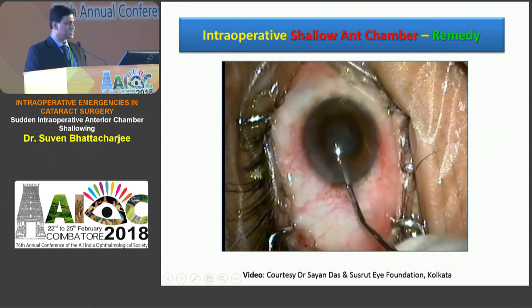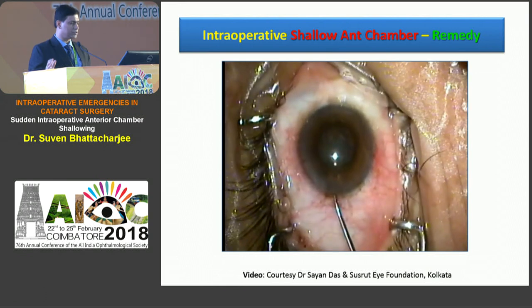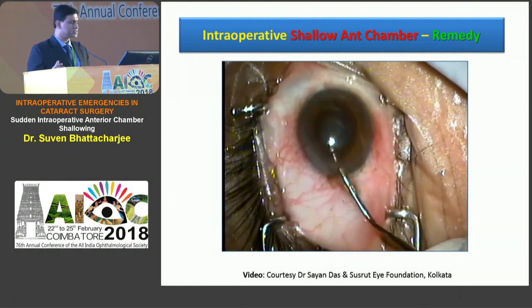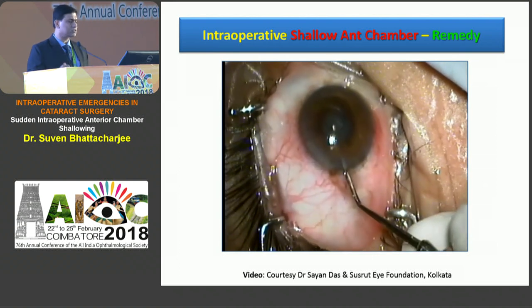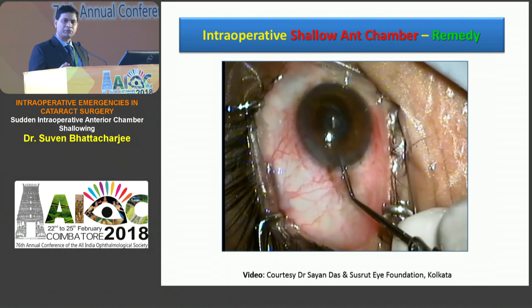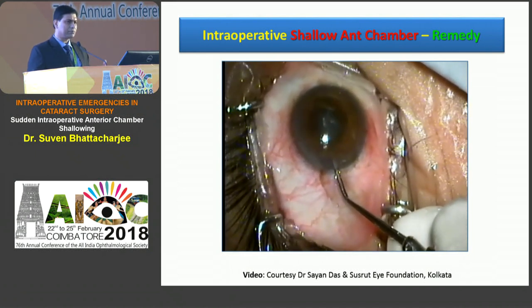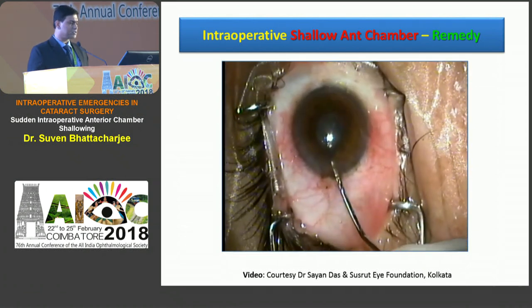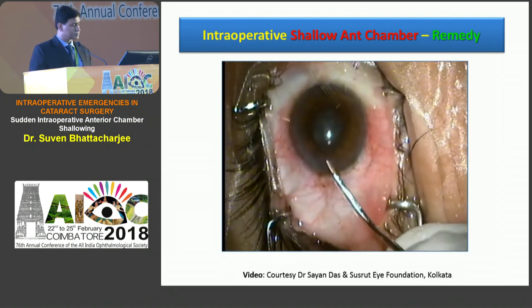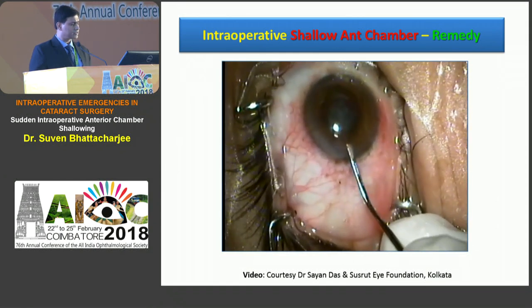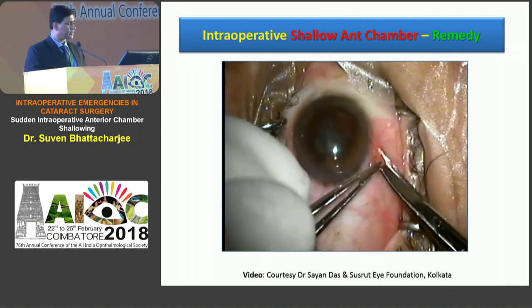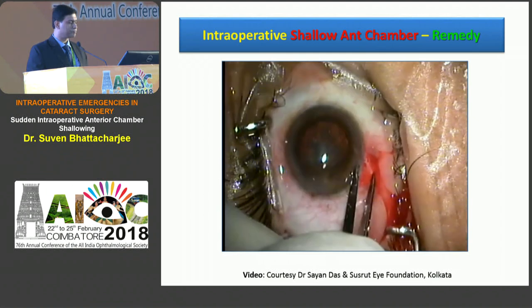In the video, the surgeon managed to reposition the iris. The supervising surgeon assessed the eye as hard. They realized a lot of fluid had been pushed into the bag and surrounding space, so they began constantly decompressing the capsular bag area — pressing and pressing — which caused some fluid regurgitation and the eye began softening, but it wasn't good enough. The iris prolapse was repositioned but still not adequate. After further attempts, they gained some hold on the case but it still wasn't good enough. They proceeded to make a conjunctival incision and planned for a pars plana vitrectomy.